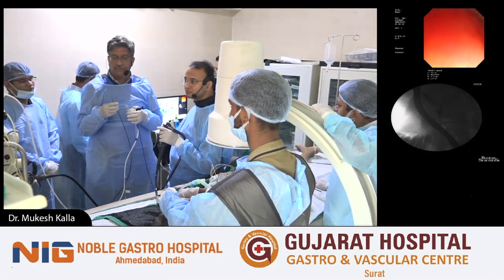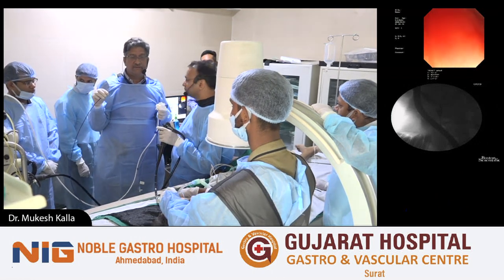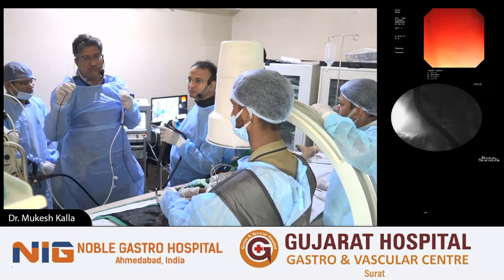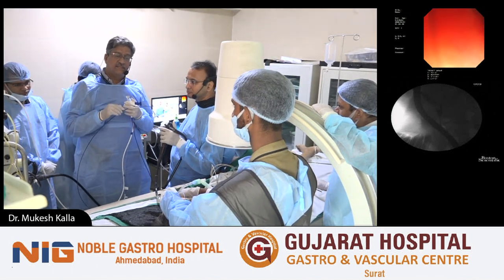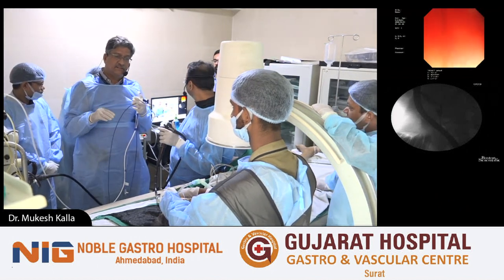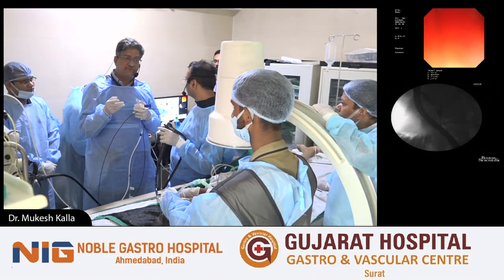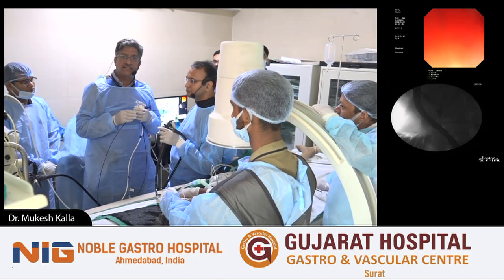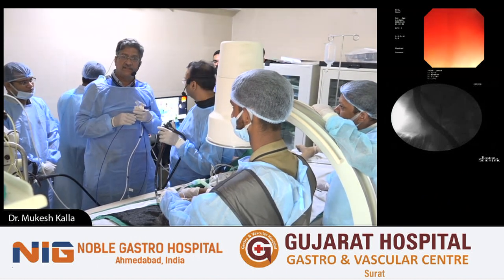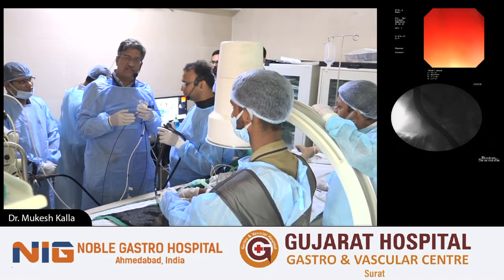Visible, audible, beautiful. Okay. So, Somil and I have started this case. Somil has removed the stents which were placed earlier, and we did a cholangiogram. The lower CBD is very narrow, and as Dr. Goenka mentioned in his talk, this is a difficult stone for two reasons. One is it looks like a Mirizzi, because the stone is in the cystic duct and the lower CBD is very narrow. So this is a perfect case for using a cholangioscope.